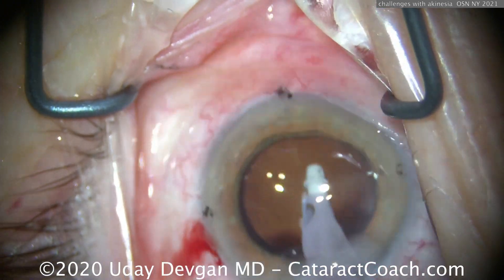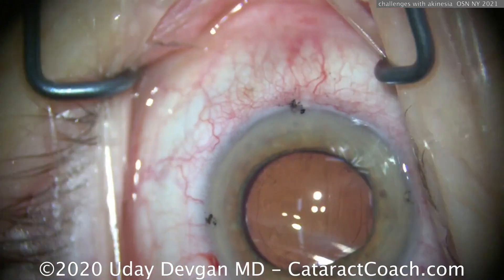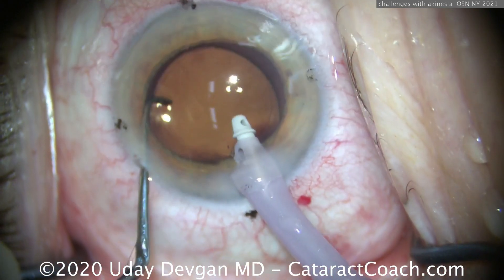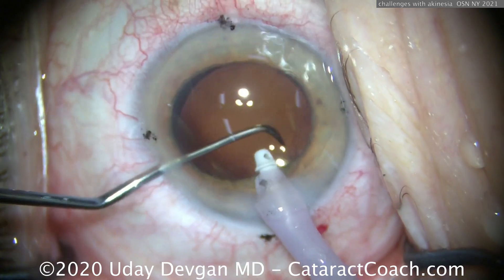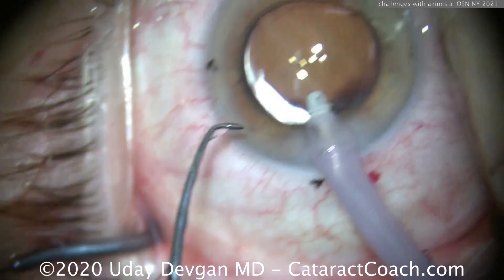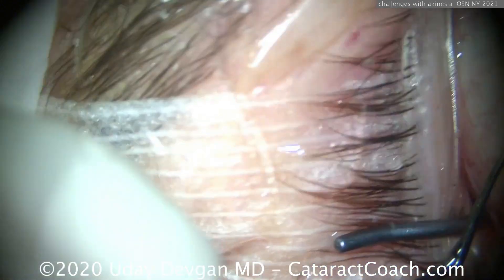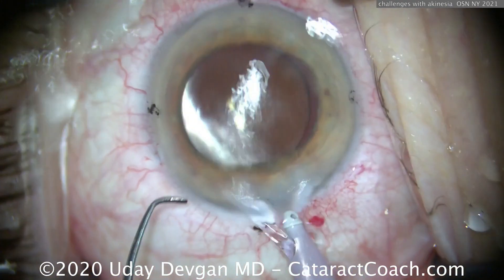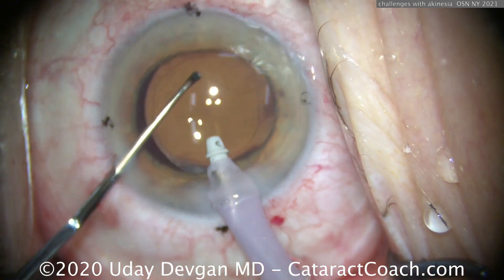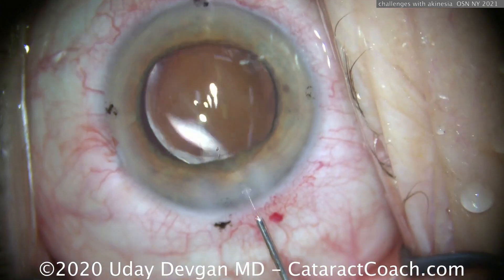Keep in mind the high-risk parts of the procedure. The rhexis is very high risk — we did that in multiple steps. The incision: diamond keratomes are incredibly sharp, so really time that incision correctly so you're right between shakes. The lens has rotated to the proper position — be careful. If I think she's going to shake, I want to come out of the eye; I don't want that chopper to break the posterior capsule, otherwise the lens can't go in the sulcus. Come out, let her get her movement done, go back in, get this thing reoriented little by little. I have a couple of seconds — wait until she gets through the shake.